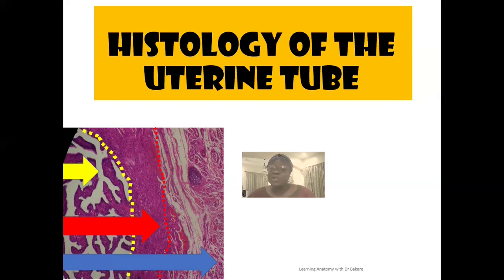In this lecture, I'll be looking at the histology of the uterine tube. I've put up a lecture on the gross anatomy of the uterine tube. If you've not checked up that lecture, please kindly go and do so to keep yourself updated. But for the purpose of this class, we would be focusing on the microscopic anatomy of the uterine tube.